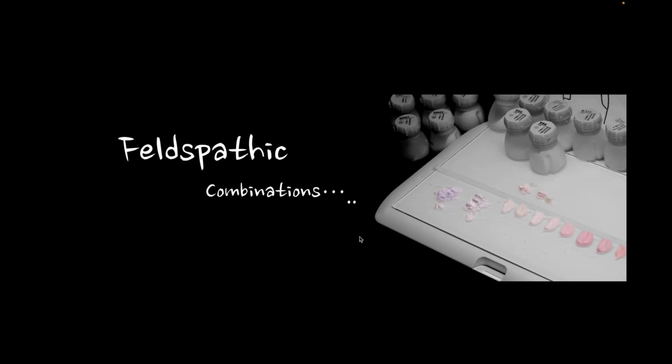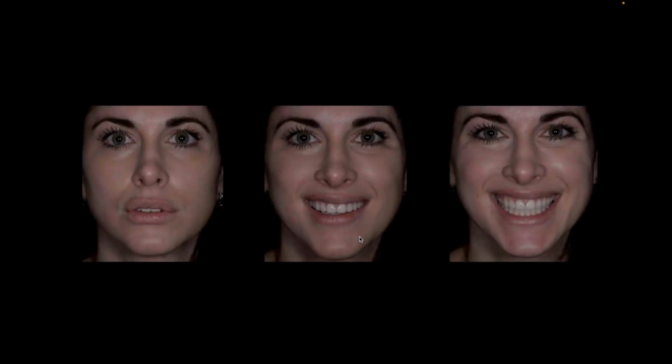Combinations are, I think, really more the challenging scenarios, and that's when we want to use monolithic materials or we want to mix materials. So for me, in this case, I'm going to do a little bit of both. I'm going to use some monolithic materials in the posterior and some feldspathic veneers in the anterior. This is Liz, by the way, and you can see that Liz has a really big smile. When she gets up there, you can see she shows a lot of everything from the gum tissue and a lot of tooth, and she's got a great boisterous personality.